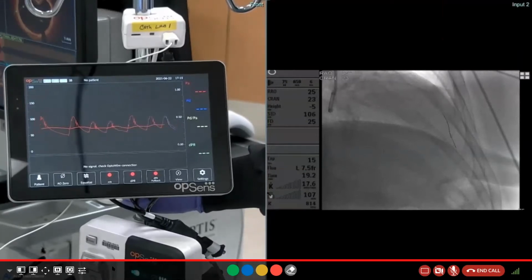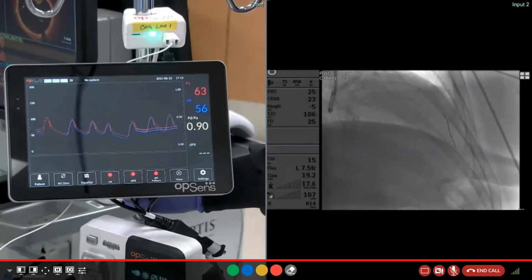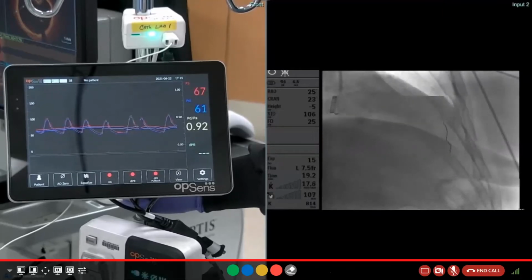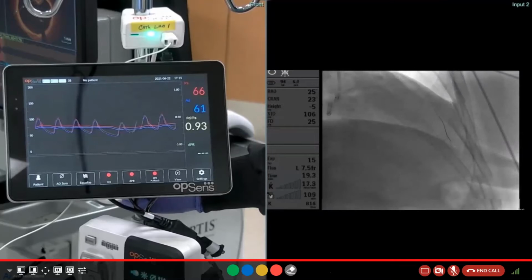How does it feel different between robotic and the hand tactile? I know that's different, but how's the control of the wire? I want to talk about the durability and the torqueability of the wire. Yeah, I think that's an excellent question, and you saw here, and of course, I want to show how easy it is. I'm catching every septal there is, but I'm not sure I wouldn't have done that with my hands. The reality is, though, that it's actually quite easy.